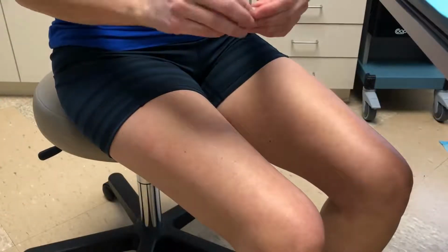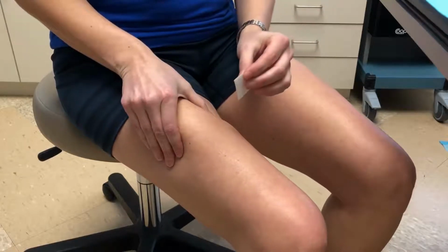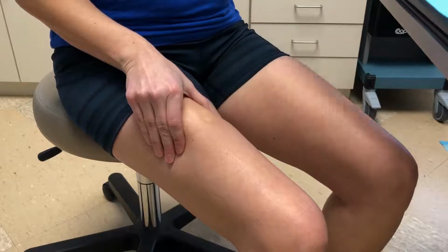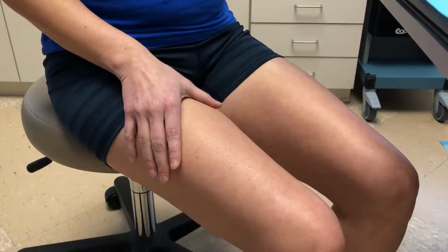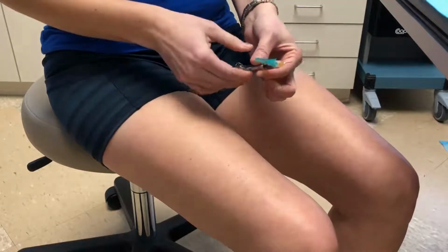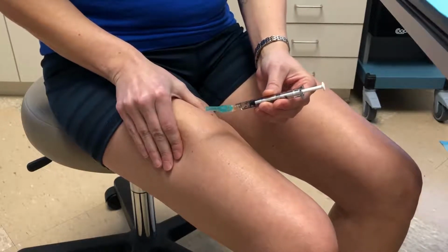Open your alcohol prep pad. Pinch the skin, and in a circular motion wiping away from your injection site, clean the skin and allow to air dry. Pull the cap off your needle. Pinch the skin. Insert the needle at a 45-degree angle.